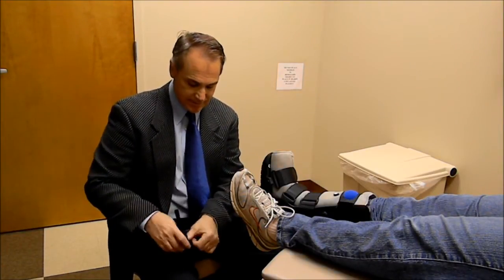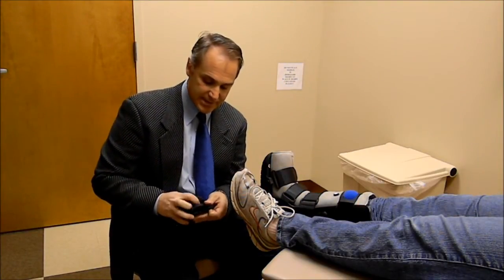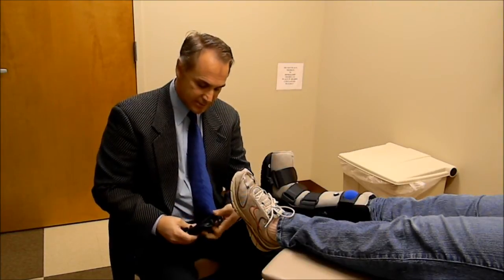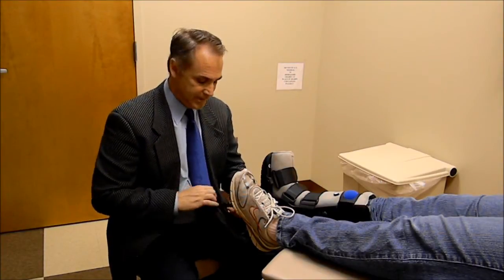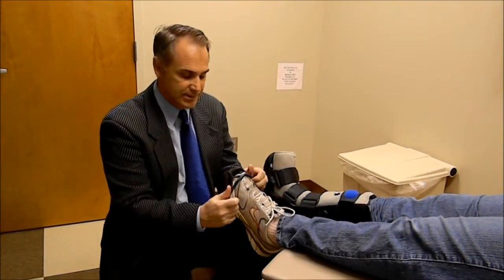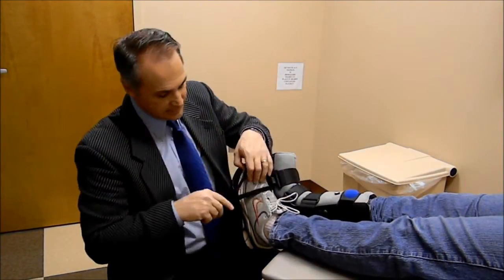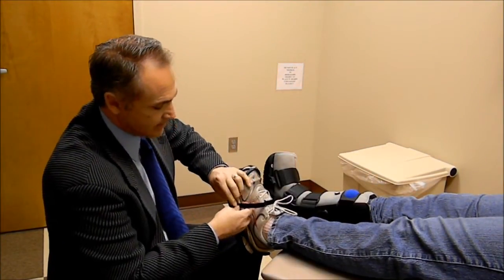What you'll see here is there's a midsole with pegs in it that comes out easily, so that if you only need to add about a centimeter of height, you take that layer out. If you need the full two centimeters — which is typical and average — you wear the entire sole. It stretches on over the shoe very easily: tip of the shoe, toe, and then around the back like that. Then there's a strap that goes across the front of the foot to aid in cinching the device down and keeping it in place.